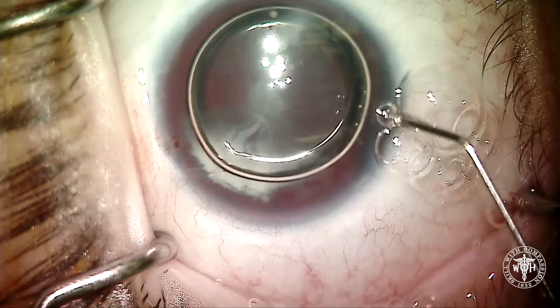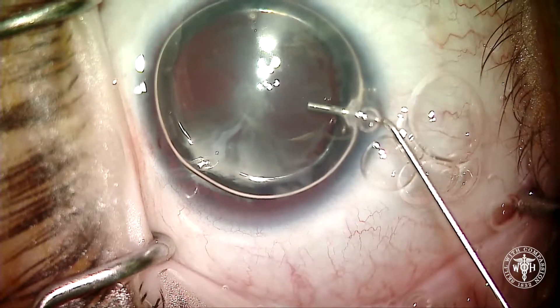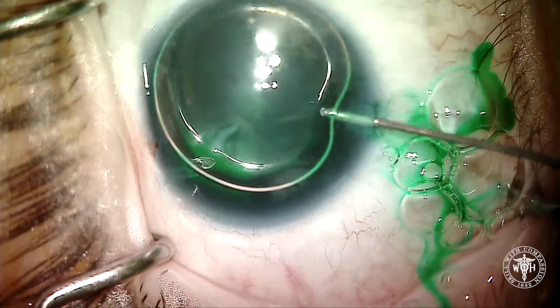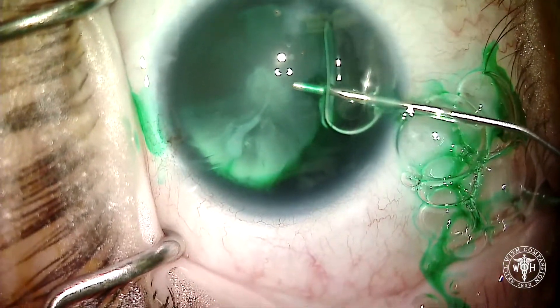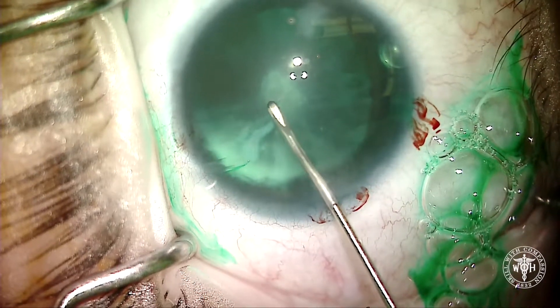In this case we're not going to use Vision Blue to help with the cataract portion; we're going to go back to using ICG. Vision Blue has been noted to cause the capsule to become a little bit more fragile, and in patients with aniridia who already have a very thin capsule, we don't need to make things any harder.